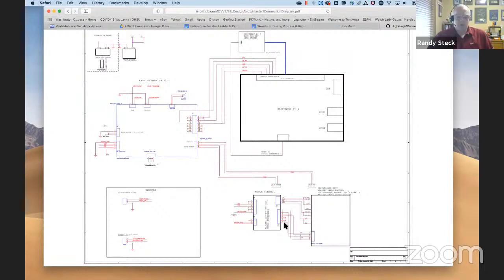Yeah, the stepper motor that we chose, you have to realize there were a lot of independent efforts trying to do the ventilator development. Most were using commonly available stepper motors. What we ended up doing was we realized that one of the limitations for this system was having enough power to squeeze the bag and to have the responsiveness so that we could control it precisely.